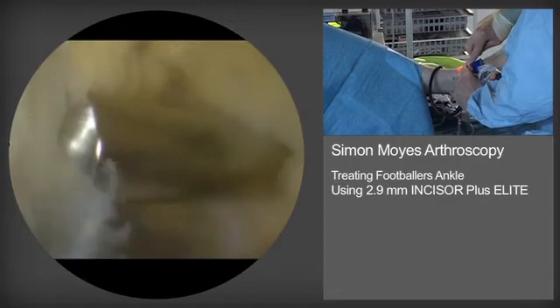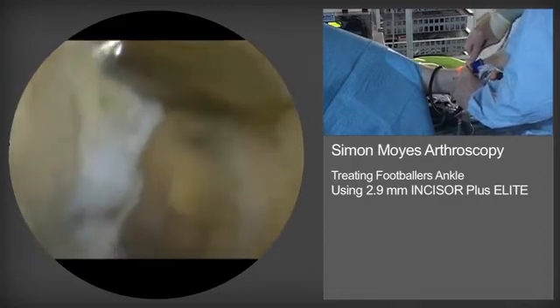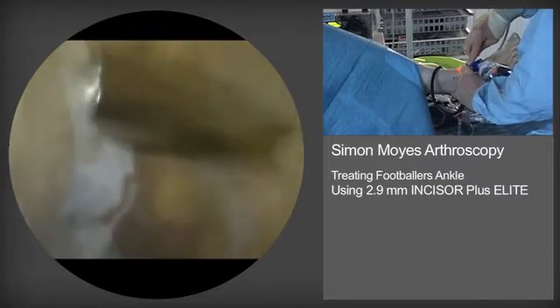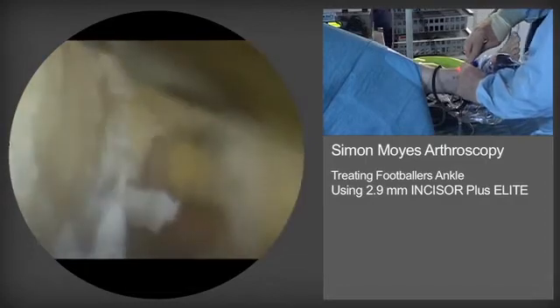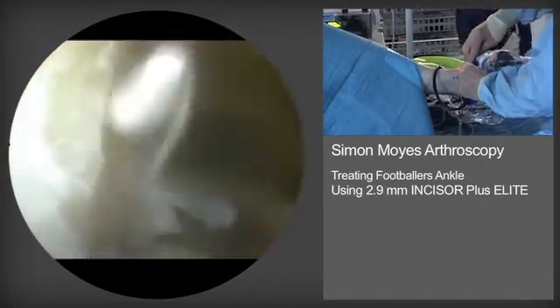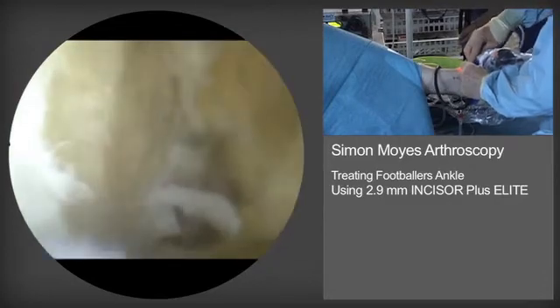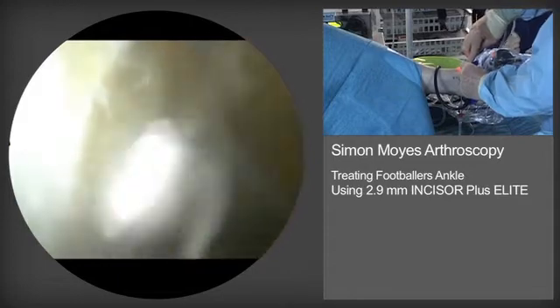The snowstorm effect sometimes seen is simply bone dust thrown up by the burr surface. This will normally clear quite quickly. A nice smooth surface is being produced on the anterior distal tibia.